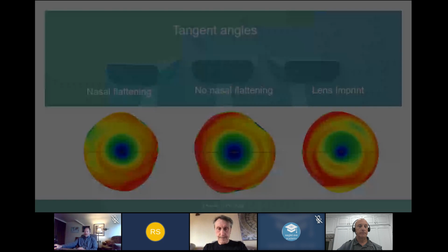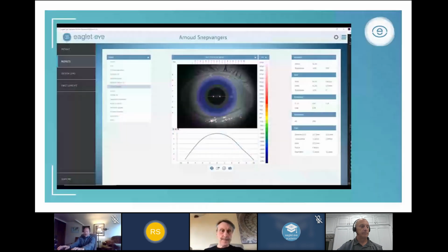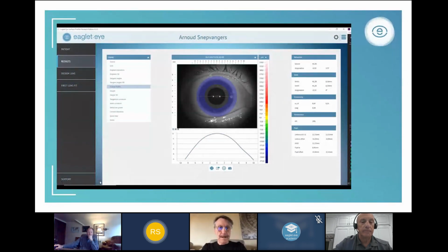Okay, I'm moving on. Now I'm going to show how the automated fitting algorithms work. Here I have a video again. Let me start it. What I'm showing here is the process, how you can, without checking all the technical stuff, design a lens.